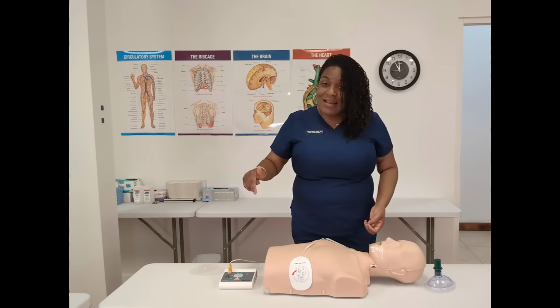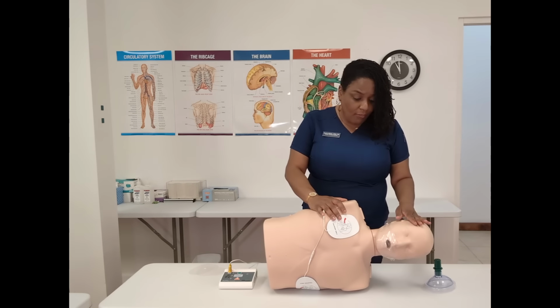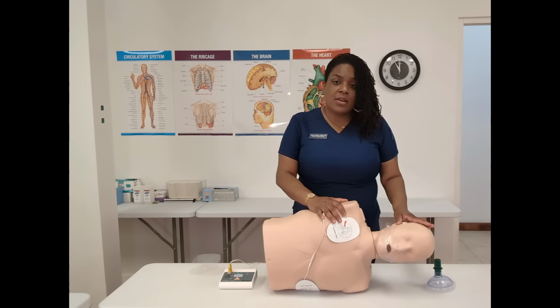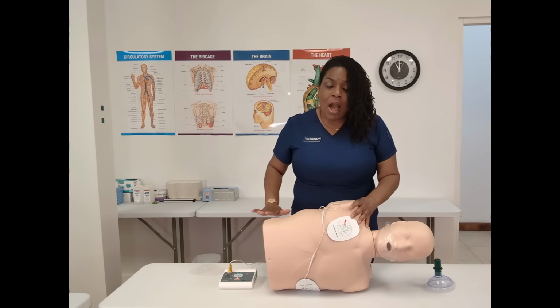So we want you to prepare and stay ready. And of course, if the person does regain consciousness, don't leave them on their back because they could vomit. Once you've stopped your CPR efforts because the person has achieved a pulse or they're breathing, you want to put them on their side in a recovery position with the AED still monitoring them.